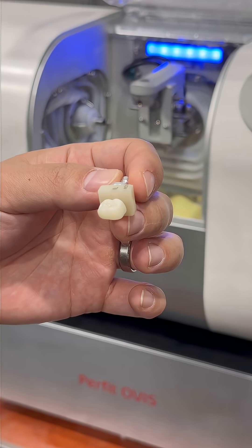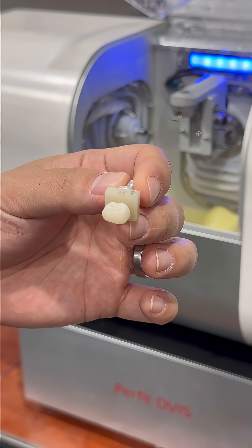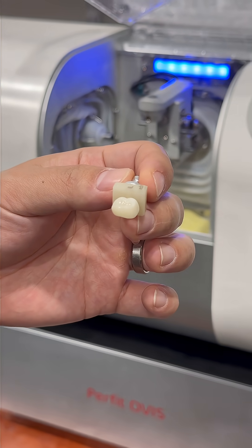One of the good reasons about the Perfit FS is because it's pre-sintered, so you don't have to spend 12 hours sintering it. You can just do it all in-house in your dental office from start to finish — maybe 30 to 40 minutes — instead of sending it to a lab, waiting a week, and getting it back.